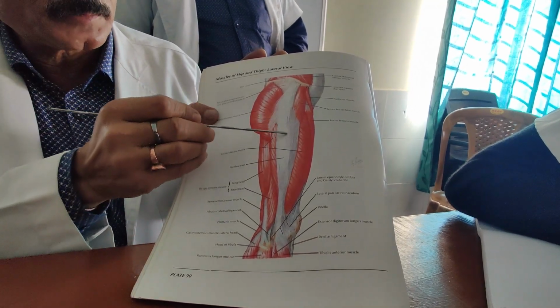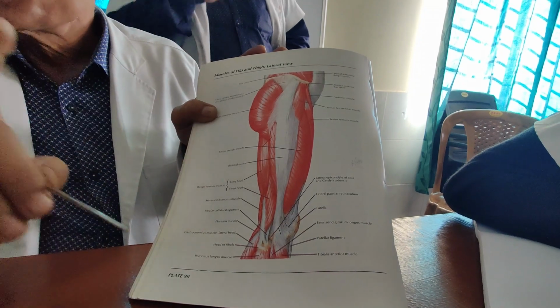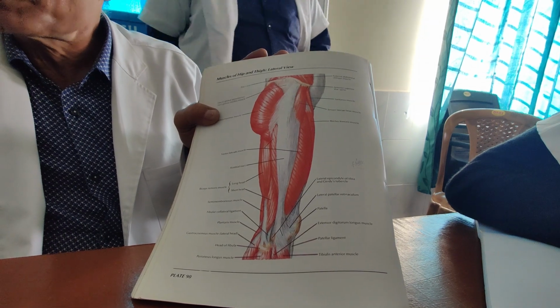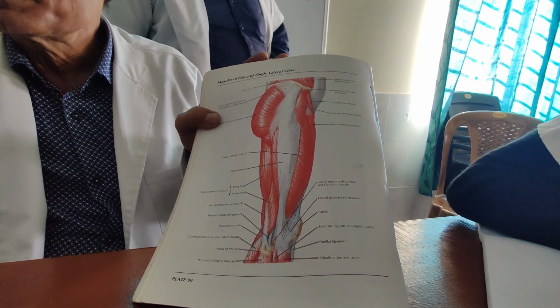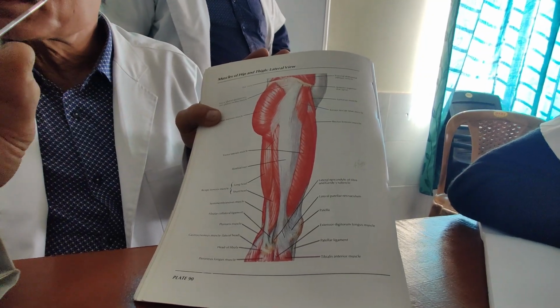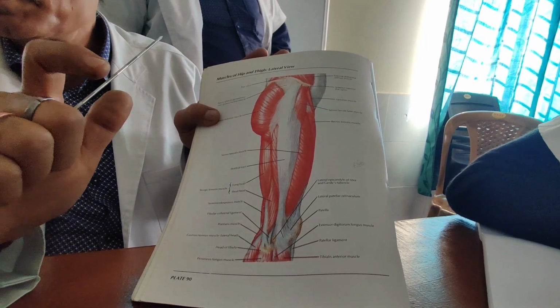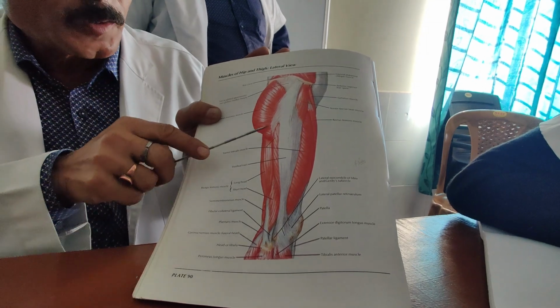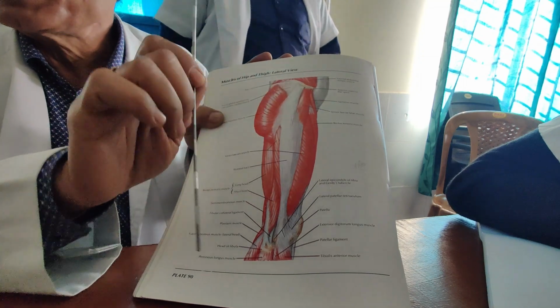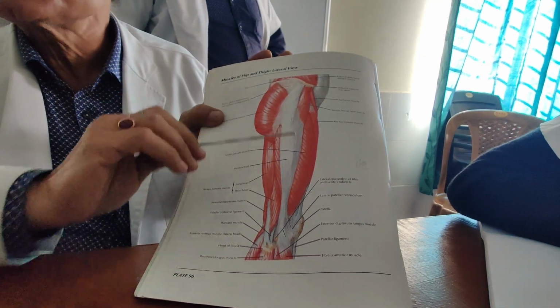One, you can cut through the middle. Particularly in a thin-build person, this is probably easier to do. Cauterize the vessels which are coming, otherwise they will bleed. Or you can reflect the muscle anteriorly. While doing so, you have to detach the muscle origin.